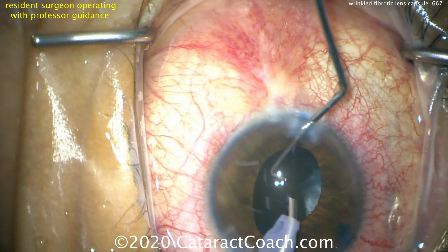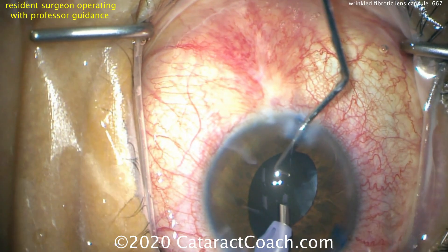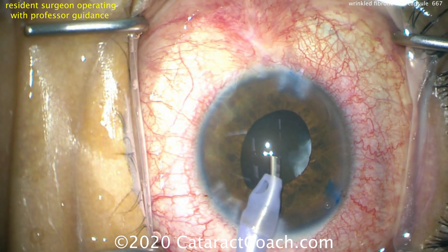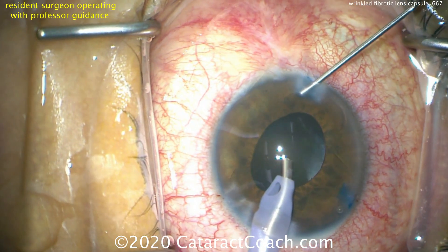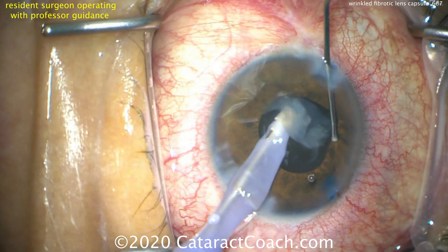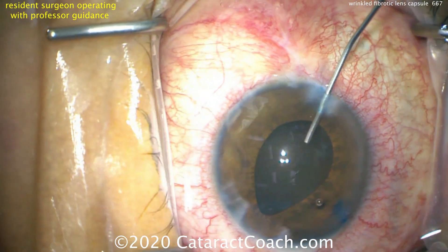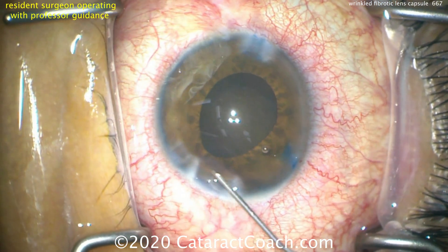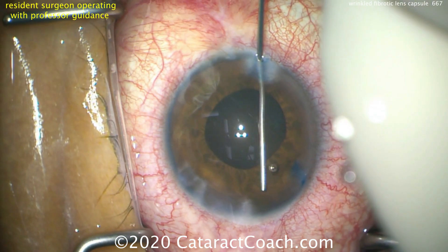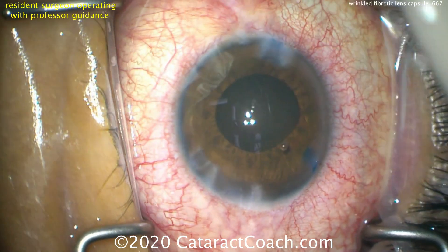Removing the nucleus — that looks pretty good. The pupil has come down a little bit as well. There's a little bit of cortex left there in the capsular bag; you can try to grab it with the phaco probe but it may be easier just to use the IA probe. Now we have to be careful not to let the eye deflate — injecting BSS and keeping it inflated. Using the IA probe we'll remove the lens cortex. We don't want the anterior chamber to collapse because if it does we could have forces placed on that weakened capsule and could have a radialization.